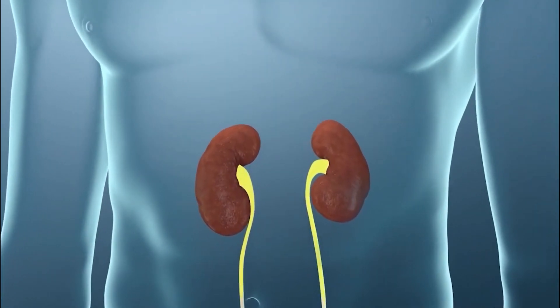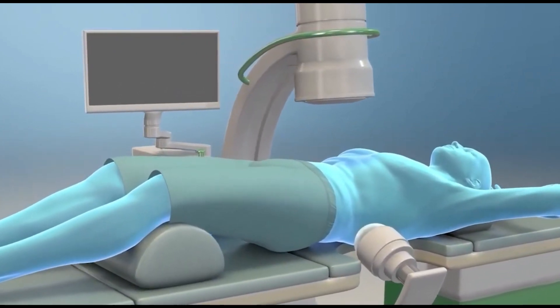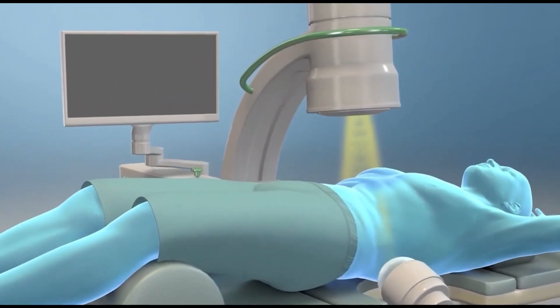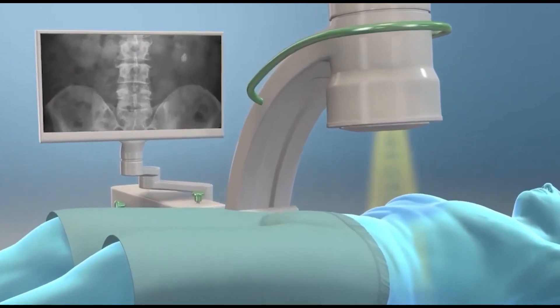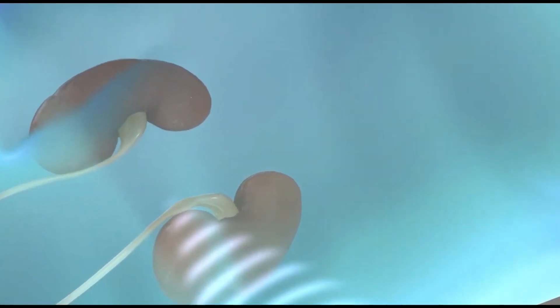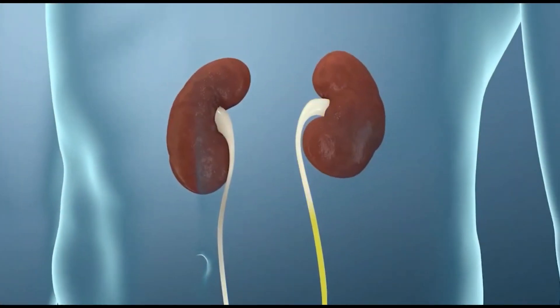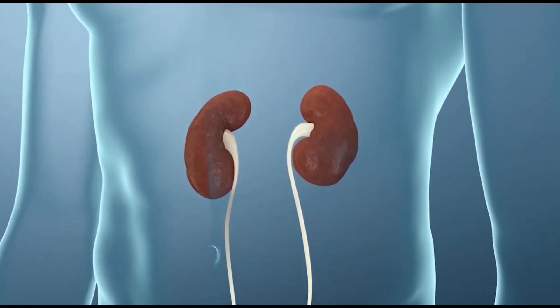ESWL uses shock waves to break down stones. A surgeon uses a lithotripsy machine to aim sound waves directly at the stones through the body, breaking them into small pieces. The waves only affect stones and will not harm muscle, bone, or skin. The procedure takes about one hour and usually takes place in a hospital. In most cases a person can go home the same day and should pass the stone particles over several days or weeks through urination.